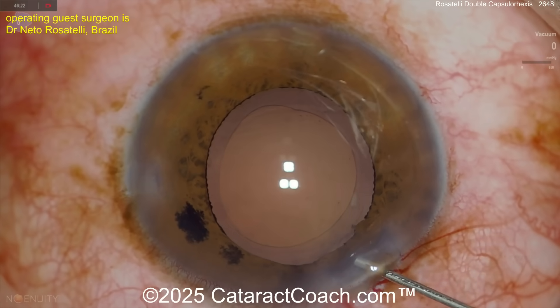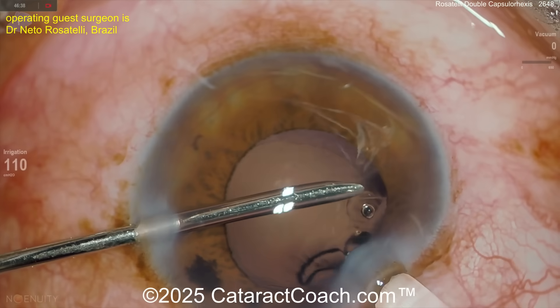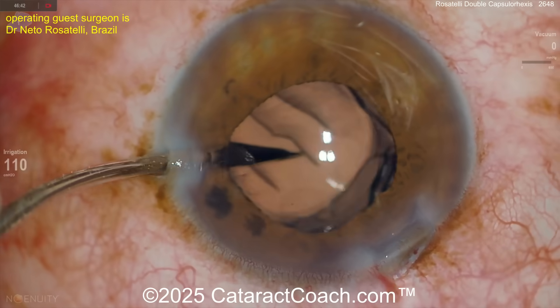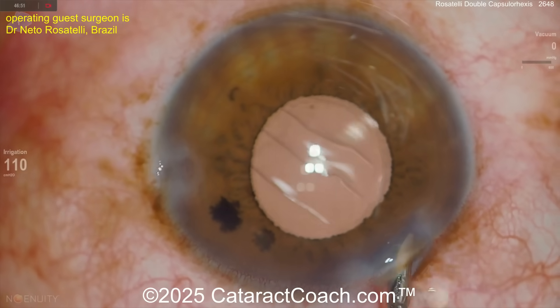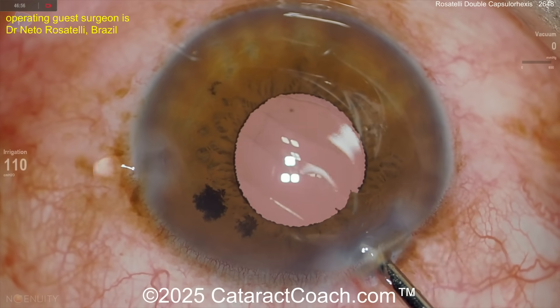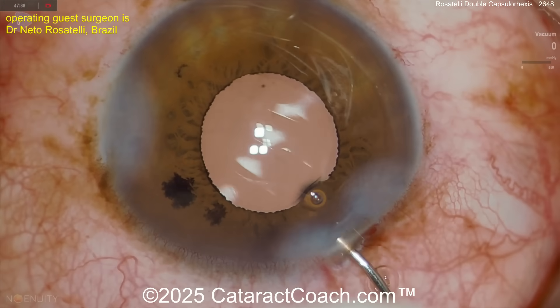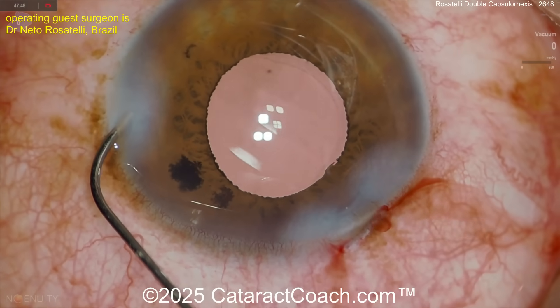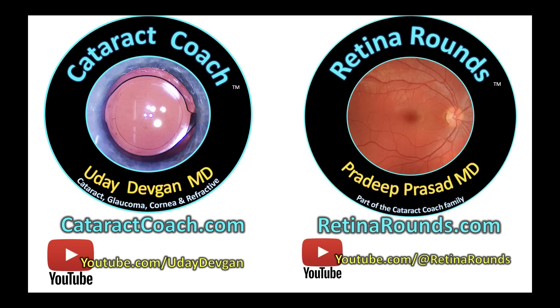At the end of the case, looks like putting BSS in for hydration. Left hand has the BSS infusion, right hand delivers the lens, and you get that tucked into the bag. Then there's no more visco — seal up the main incision with some hydration. Beautiful job. Thank you, Netto. Remember to check out Netto's channel on YouTube — so much great material to learn.